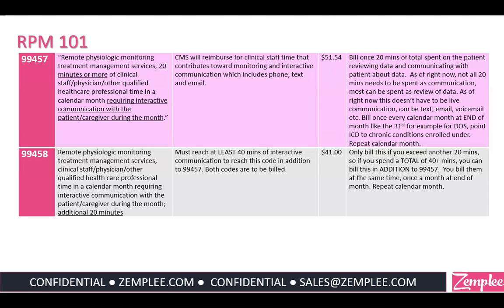It just talks about the fact that you reviewed the data and what you saw, and it could be general. You don't have to talk about the actual numbers, but you just talk about trends or patients looking stable, no alerts, no trends in the wrong direction kind of thing.